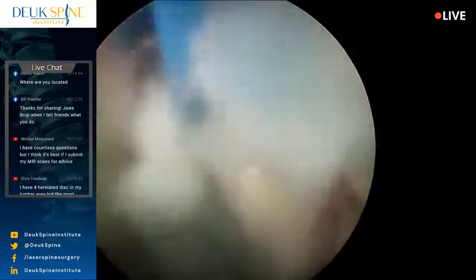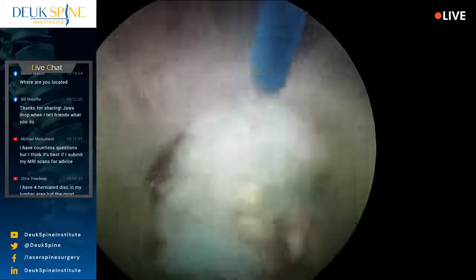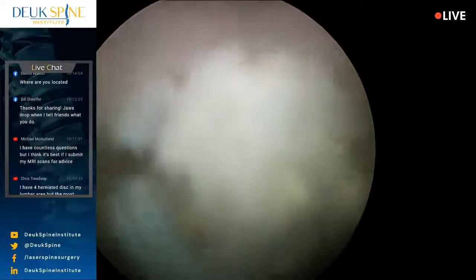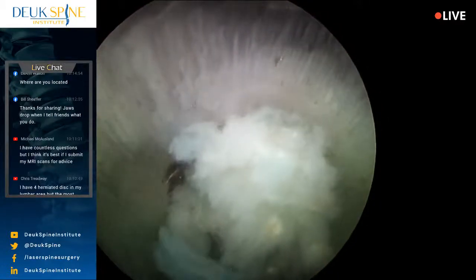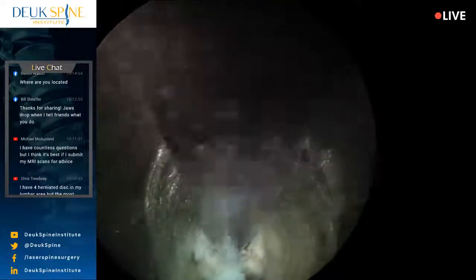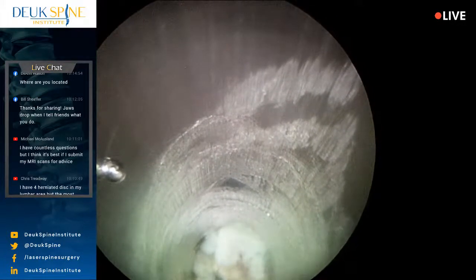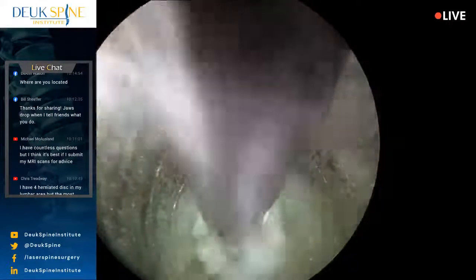Woo! More herniation. Look at that. There's some granulation tissue. Did you see that pink stuff? Man, this is a big herniation here. Let's try to grab it out. It just keeps coming. We call a herniation that herniates into the tube while we're removing it a reverse herniation. There you go, a little bit. Because it's gone from herniating out of the disc to coming back into the disc area or the tube for us to remove.